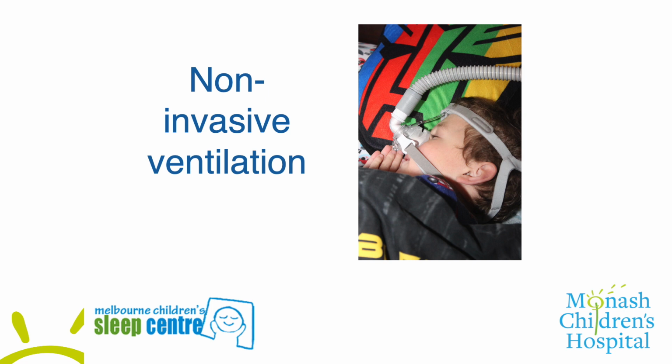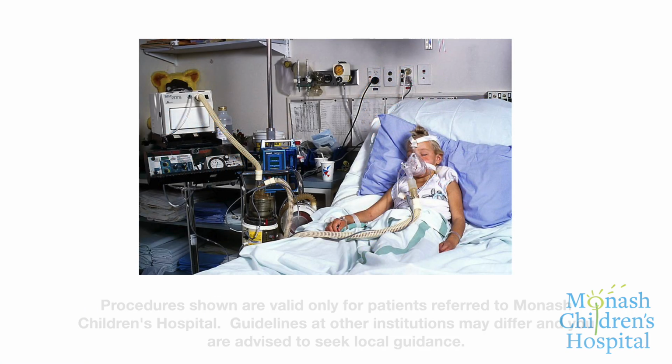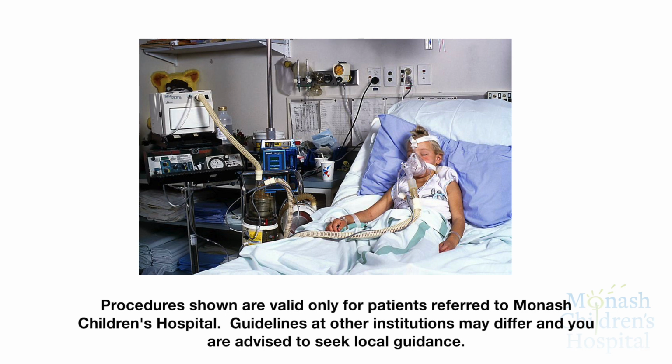Non-invasive ventilation is simply positive pressure ventilation delivered via a mask applied to the child's face. The machine used is simplified for use at home, but the settings are comparable to positive pressure ventilation in other settings. Patients may be using these modalities at home, but the purpose of this video is to provide guidance to using therapy in a hospital ward setting.